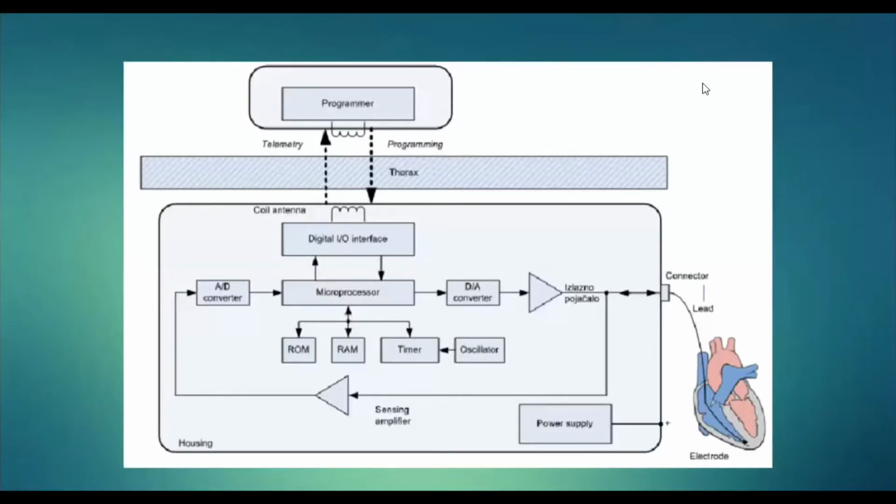This is the schematic representation of a pacemaker, and I'm going to explain the function of the components. We have the output circuit here, and it contains the output section and voltage multipliers. Multiple capacitors can be used to achieve the desired output voltage. And we have a sensing circuit also, and this circuit filters unwanted frequencies.